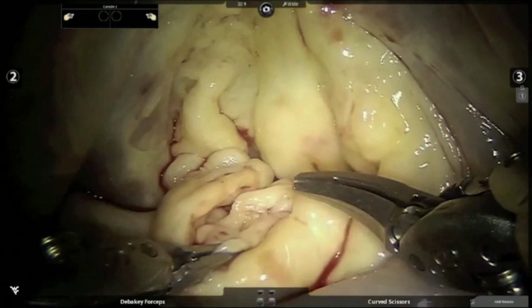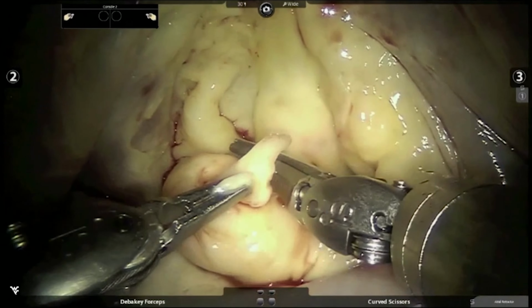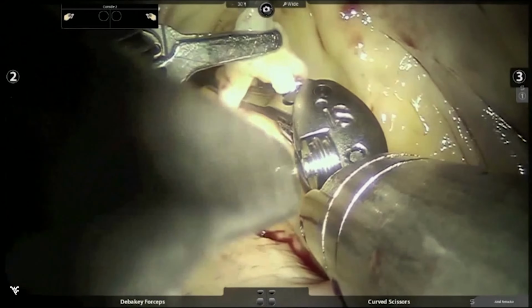And in Carpentier nomenclature, this would be called forme fruste due to the diffuse nature of the posterior anatomy.